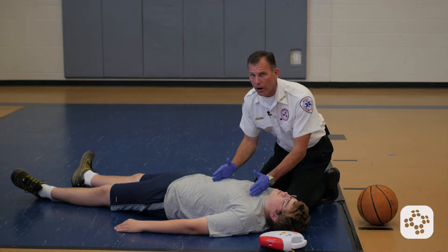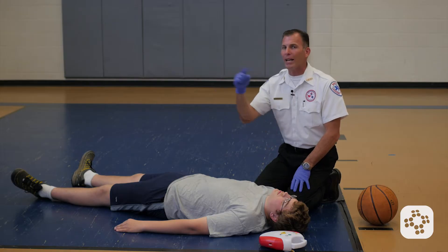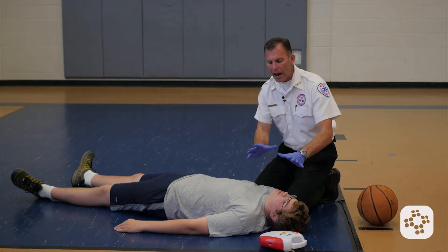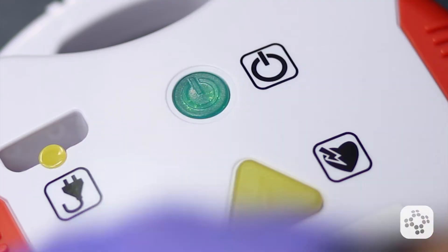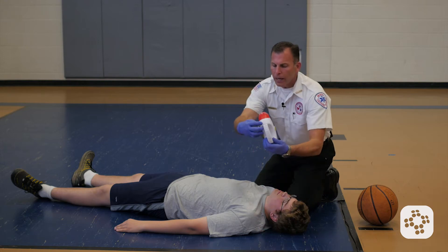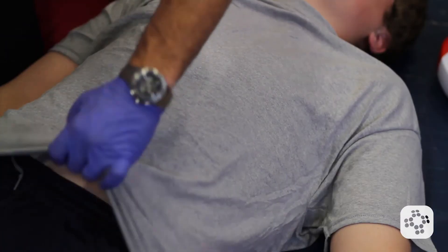So here we go. The scene is already safe, CPR has already been in progress, and whether we brought the AED in or someone else brought it in, the point is it's here and it's ready to use. When we have the AED, the very first thing we're going to do is turn it on. Remove clothing from the person's chest — it tells us to remove the clothing. Many times there'll be scissors right in the back. Attach pads firmly to the person's chest as shown.